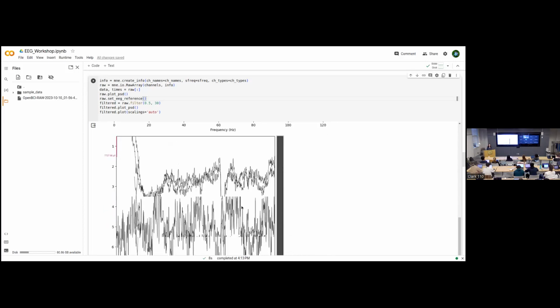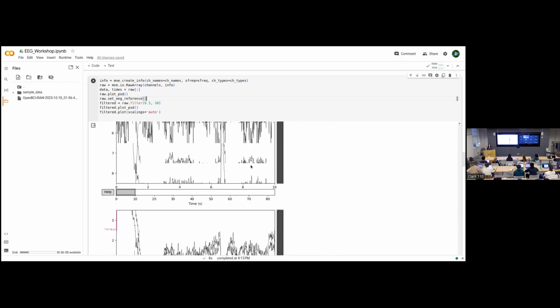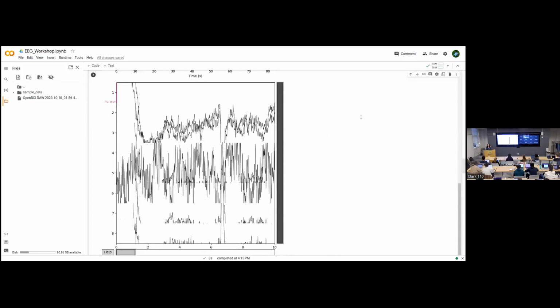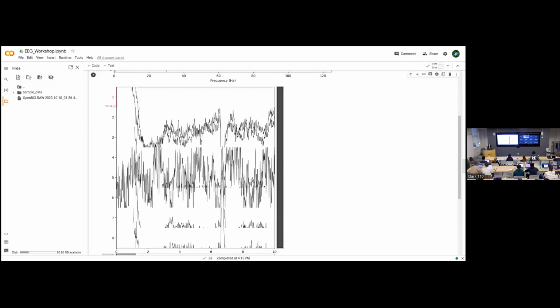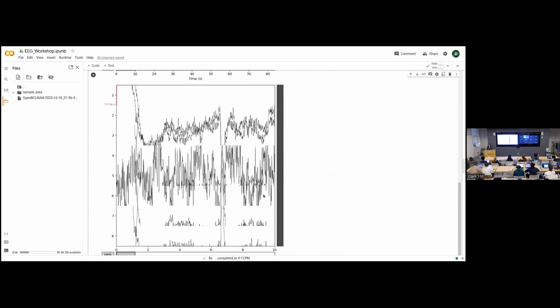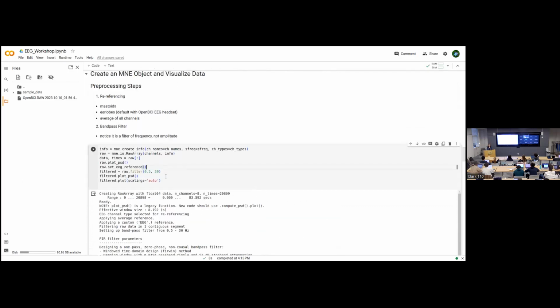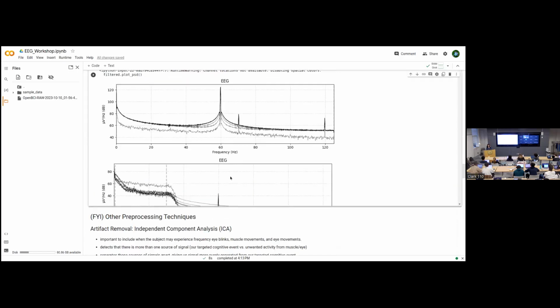And then MNE is a pretty good software, but sometimes it's not the best for customization. Here it is graphing the raw signal. So that's your 8 channels exactly the way they turn out. The reason some of them are cropped here is that MNE doesn't adjust very well for the range of signals, but it still helps you visualize what electrical activity looks like. The first one should be pre-filtering and the second one should be after filtering.